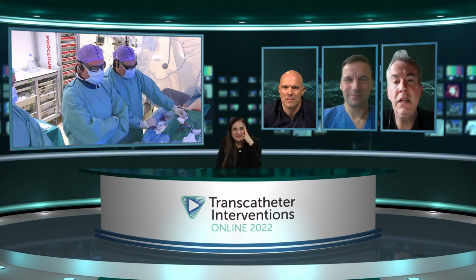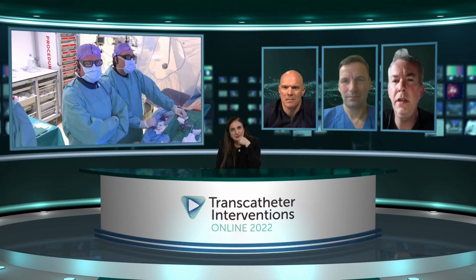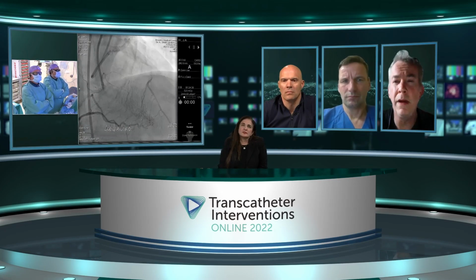I mean, the first thing is I would probably personally spend a little bit of time looking at this and trying to work out, perhaps with the benefit of IVUS, whether I think it's possible to get a safe and good result for this person with a PCI approach, now that there's this disruption of the left main. So that kind of concerns me, and I'd like to know a bit more about that.